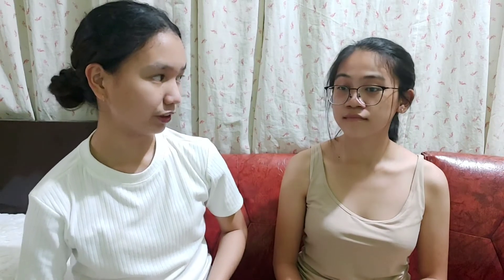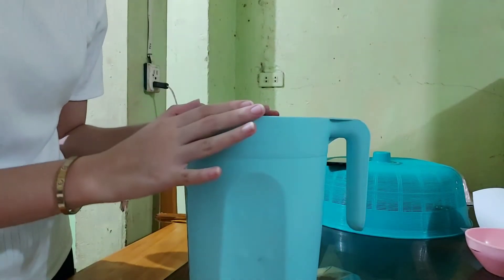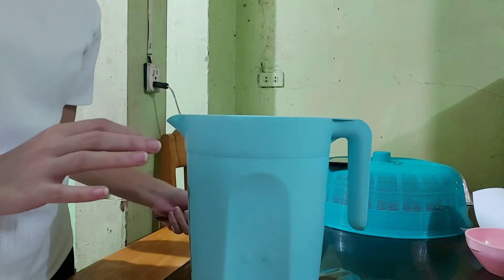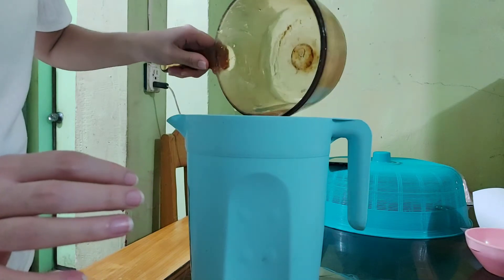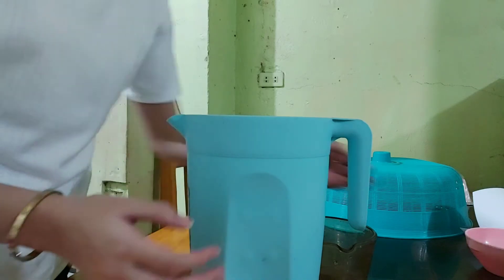My name is Rian Gift Albala and today I will be your nurse and I will be performing steam inhalation. In preparation of the steam inhalation, I will place boiling water about one-third to one-half full in this pitcher. And then I will be covering the pitcher with a towel.